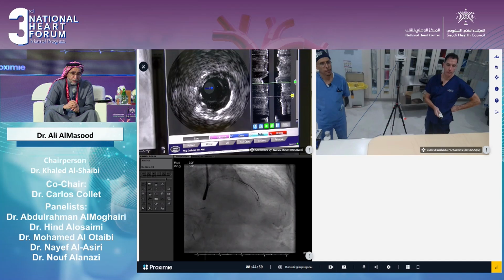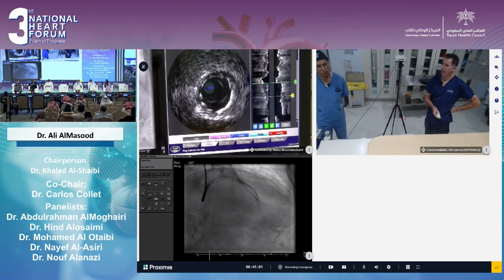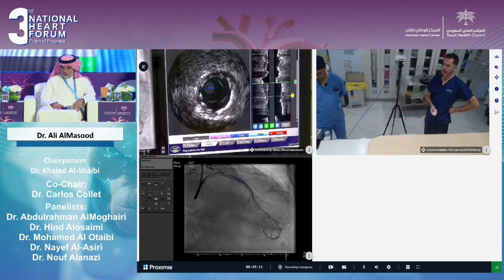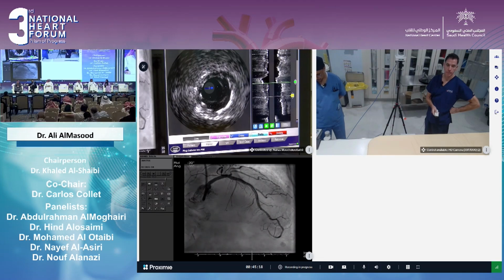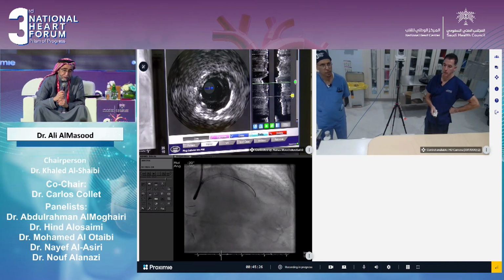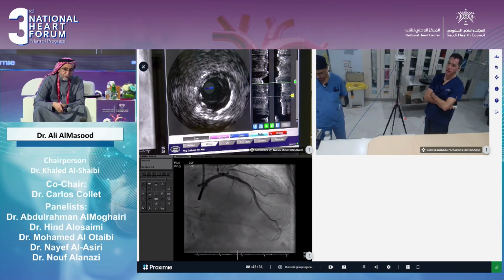Dr. Khalid, what is the left main area by IVUS, at the ostium and at the mid-distal? 11 is the smallest area in the left main, and 8 at the area of the eccentric calcification in the LAD. So very satisfactory areas. What were your MLAs in the left main and the ostial LAD after stenting? After stenting, 11 square millimeters in the left main and 10 in the LAD.